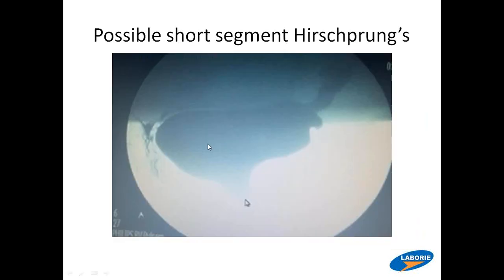Okay, so you look at this defecogram, and this is what it is. And again, if you know what it is, I apologize, but I'm sure some people don't. I do it the way I did it in training. You can use MRI and you can use ultrasound and you can do fancier defecography, but you can do it simply with a fluoroscopy C-arm and a radiolucent commode chair. We use a PVC chair that you can use in the shower, and is mounted on a stand. And we use instant mashed potatoes and barium and mix it to a consistency that's about like oatmeal, and insert it with 2 Toomey syringes. So it's up to 120 cc's.